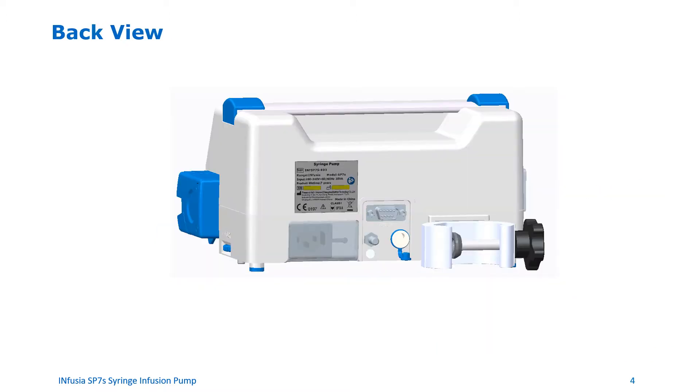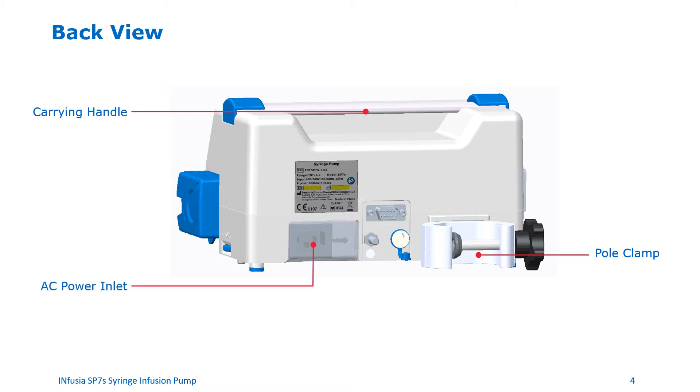Back view of the device. The carrying handle is on the top back of the device. On the back of the pump, the pole clamp is used to secure the pump to an IV pole or a cage. There is also an AC power inlet, which you can use to connect the device to AC power. There is also a name plate that has the make and model number and device serial number.